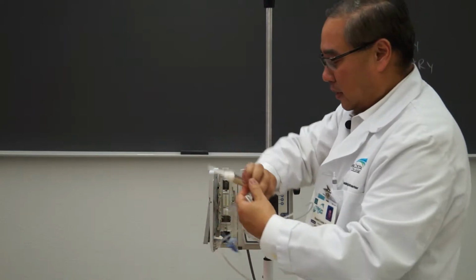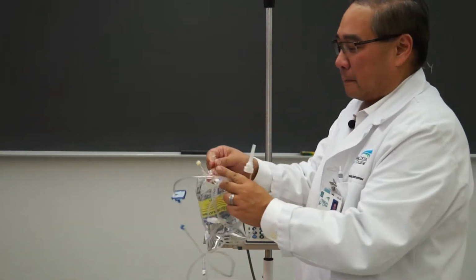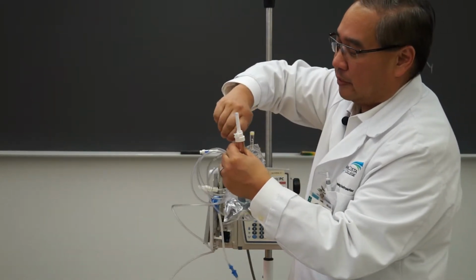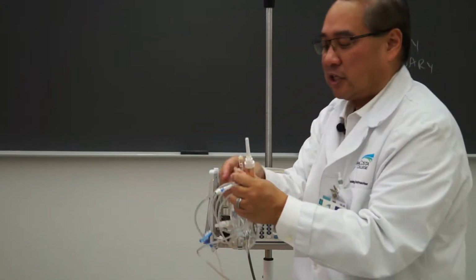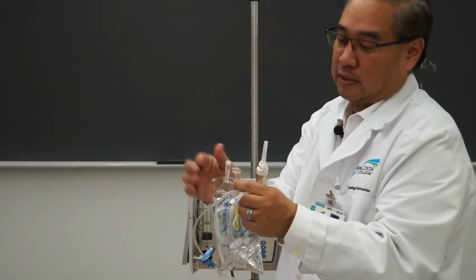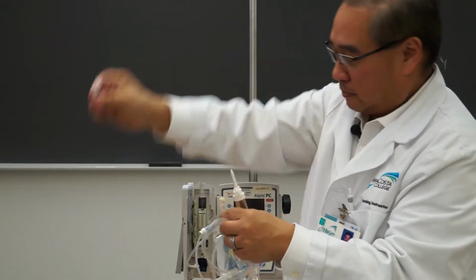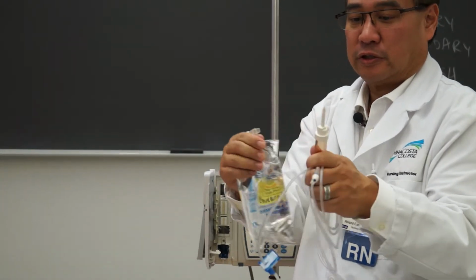So in this case now, I am going to go ahead and apply the roller clamp itself. Then I'm controlling all the ends again. I'll take the bag here that I'm going to be using. I'm going to twist off the cap here. Okay. Being careful not to touch the inside of the connector right here because that would contaminate it. Remove the cap off my drip chamber. Okay, it is sharp, so be careful not to hurt yourself.